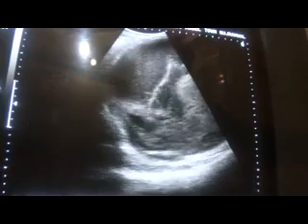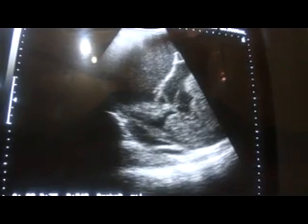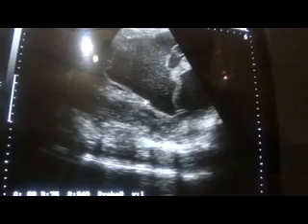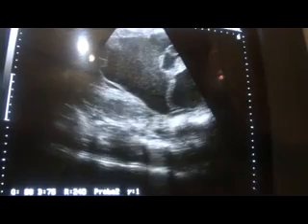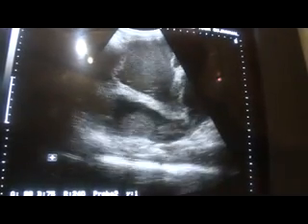Now this is a midline crossing, huge mass occupying almost all of the left abdomen and expanding towards the right side of the abdomen, expanding from the midline. This is the mass under study. This is the aorta. Proximal aorta.